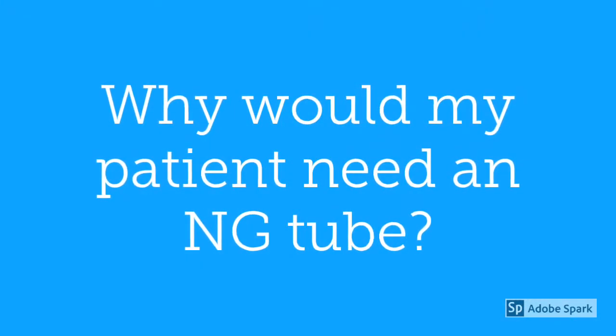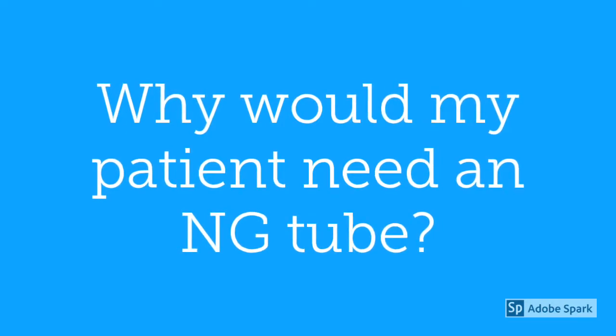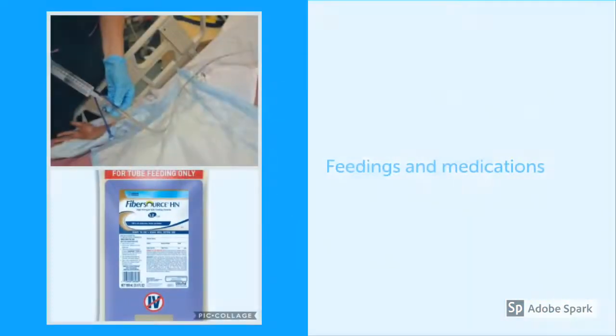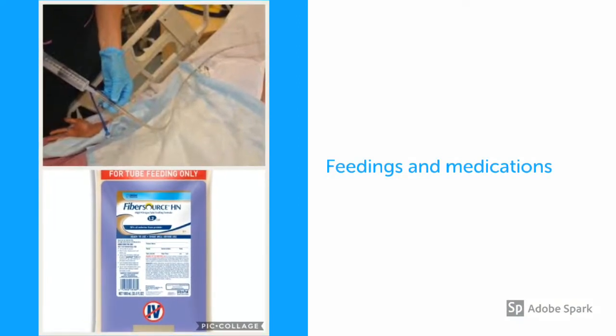Let's start with why. We have been told time and again to ask why, so why would our patient need an NG tube? First off, let's start with indications that we need it to put something into our patient. Feeding is one of the first things we think of, but let's not forget medications can go into an NG tube also. Remember that some preparations like extended release tablets and capsules should not be crushed. Talk with the pharmacy at your hospital if your patient is on a medication contraindicated to NG delivery.